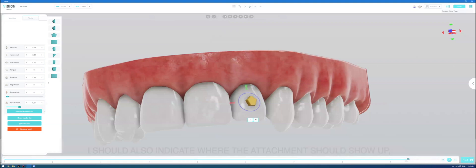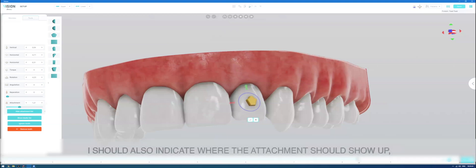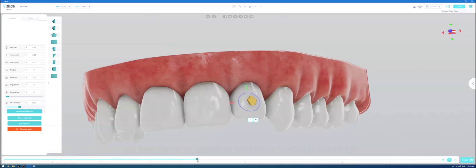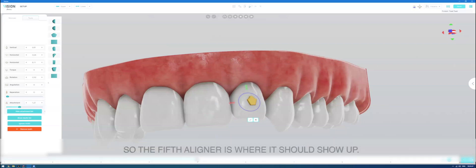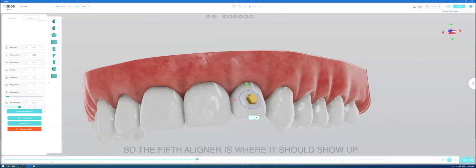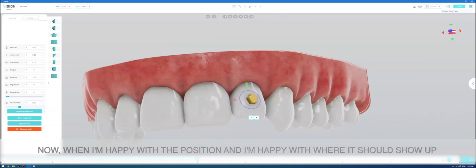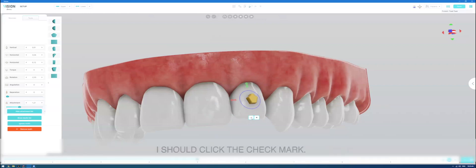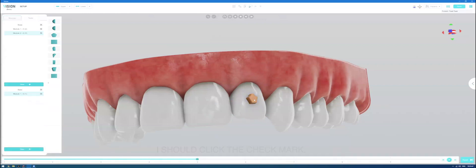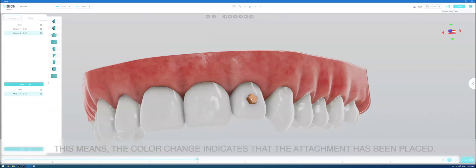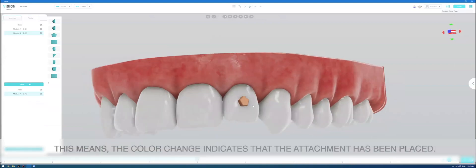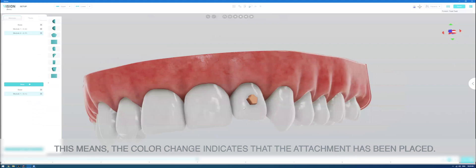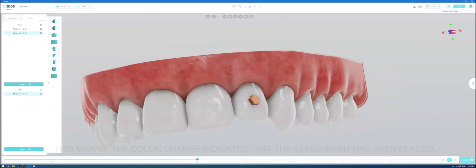I should also indicate where the attachment should show up. So, say, the fifth aligner is where it should show up. Now, when I'm happy with the position and I'm happy with where it should show up, I should click the check mark. And this means the color change indicates that the attachment has been placed.